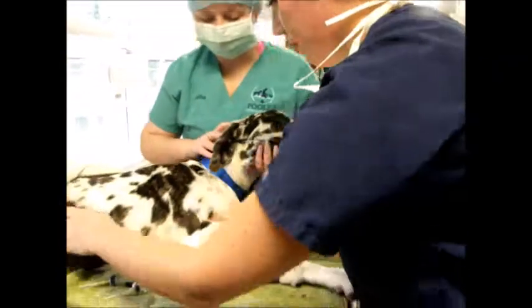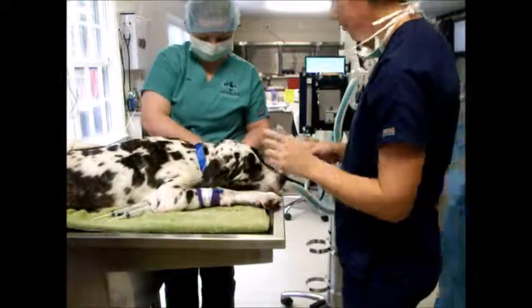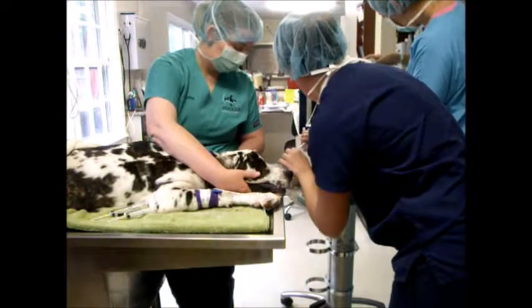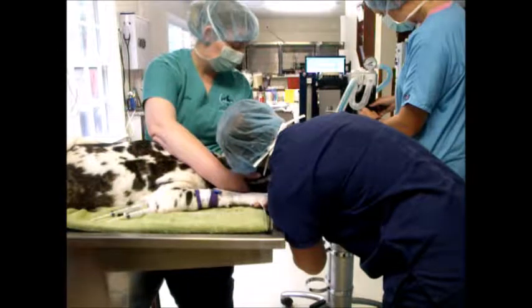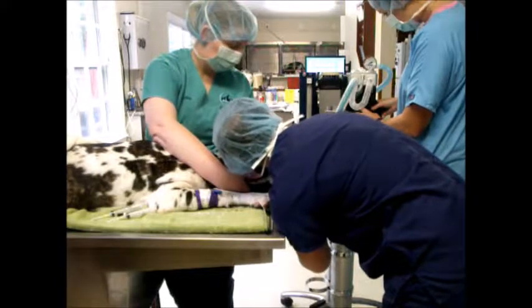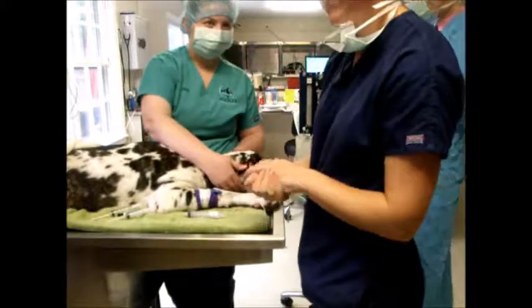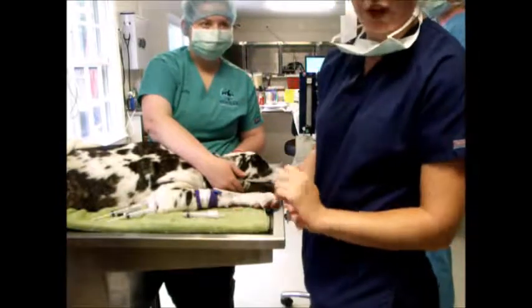Now we're going to inflate the cuff. We want to make sure that she's straight and the neck is extended. We're going to close the pop-off valve, and she's going to hold pressure on the reservoir bag while I inflate the cuff. I'm going to inflate it until I don't hear a leak anymore. We want to make sure there's no leak right around 20 centimeters of water. Now she's going to turn the isoflurane on, keep her oxygen around 1.8 to maintain her, and now we can start prepping her for surgery.